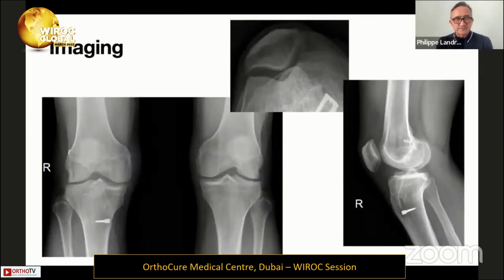You can see that the joint line are okay. We can discuss maybe the lateral femoral tibial joint line, but if you compare with the opposite side, it's almost the same. The tunnels look in good position. They are not really dramatically enlarged. It's an Endobutton on the femur and the staple on the tibia.